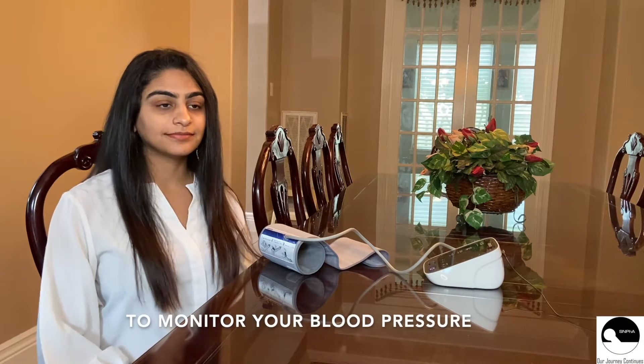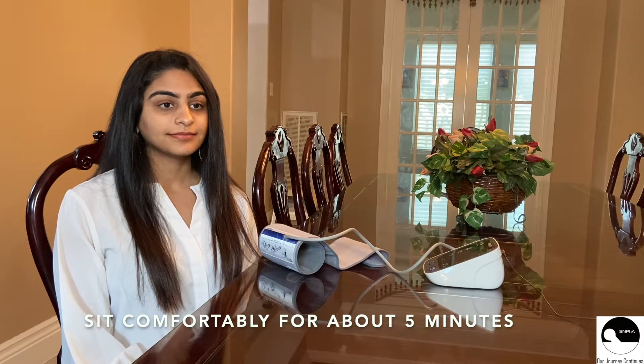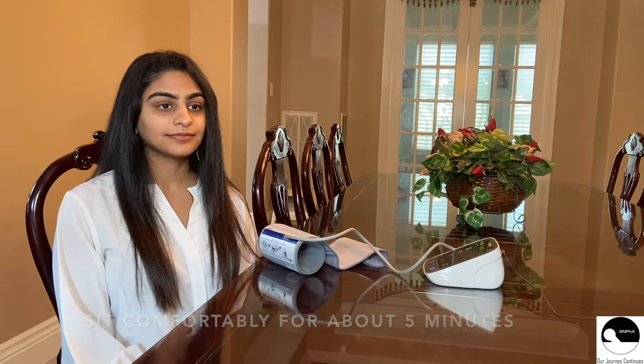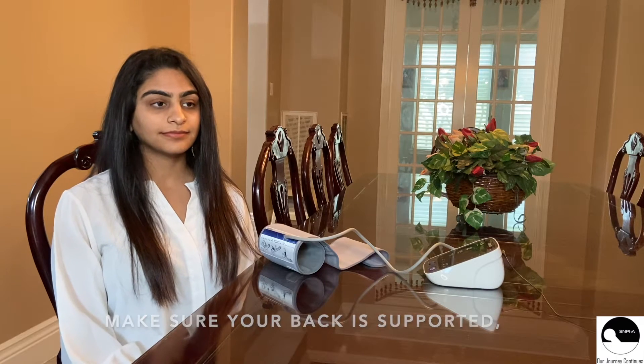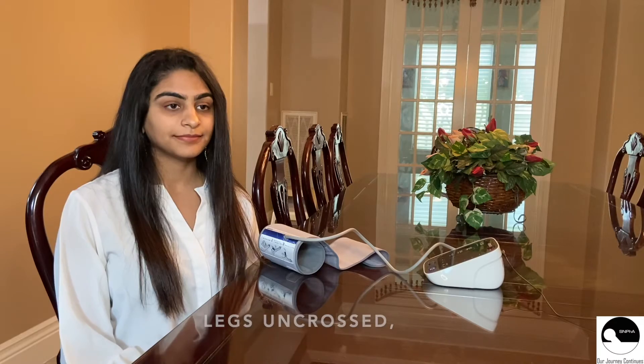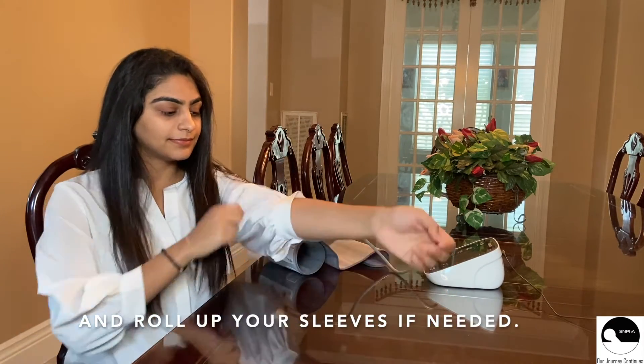To monitor your blood pressure using an automatic blood pressure machine, sit comfortably for about five minutes before taking the measurement. Make sure your back is supported, feet are flat on the floor, legs uncrossed, and roll up your sleeves if needed.